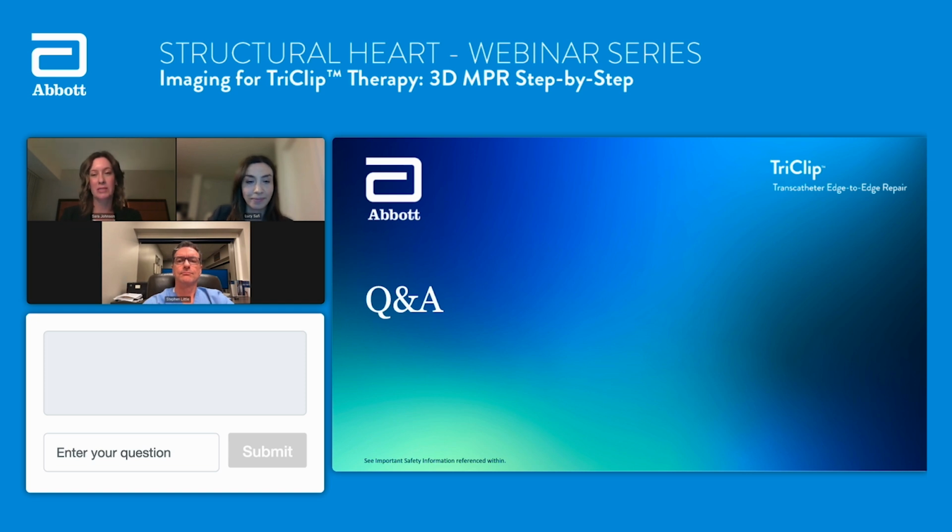Great answer. Great explanation there. I guess maybe a final question here would be, what are some good ways to practice MPR? If you're not doing MPR today and you're trying to learn it, are there some good tips and tricks to get good at it in a low pressure situation? How would you advise people to really get going and get better at it?